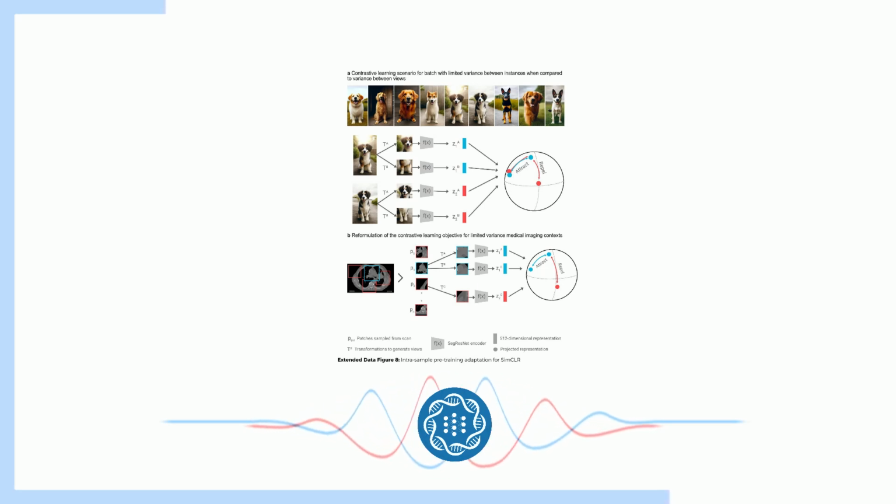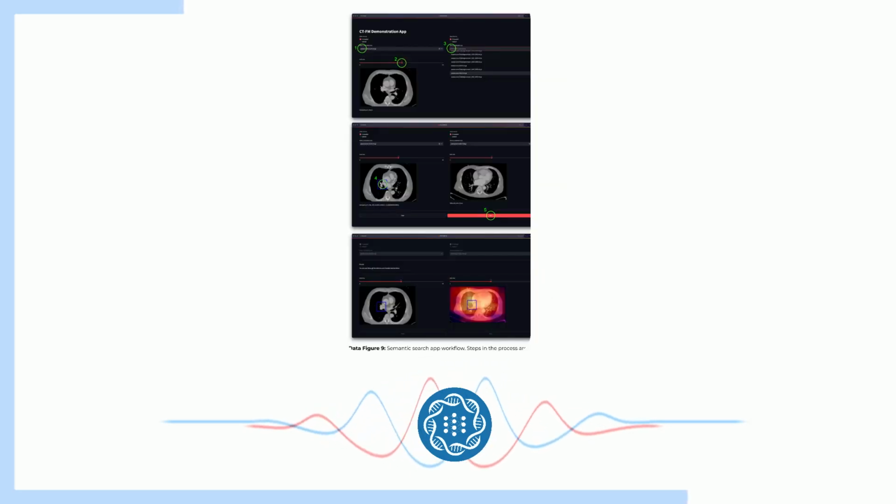They did. They mapped these PCA clusters onto a color space, creating sort of an anatomical color code. Imagine different parts of the body lighting up in different colors based on their anatomical properties. Okay, I'm picturing a human body as a rainbow. Yeah, right. So did this color coding stay consistent across different scans, even with the variations between patients? That's the remarkable part. It did. The same colors would always represent the same types of tissues or organs, regardless of individual differences. It's as if CTFM has learned a universal language of anatomy, a way of representing the human body that transcends individual variations. That's incredible.